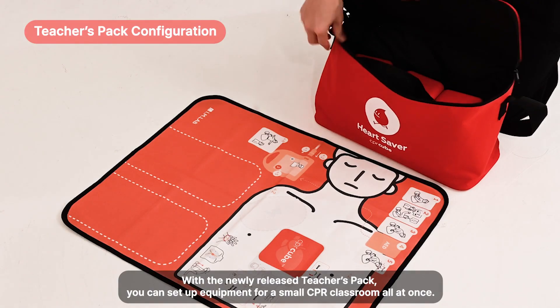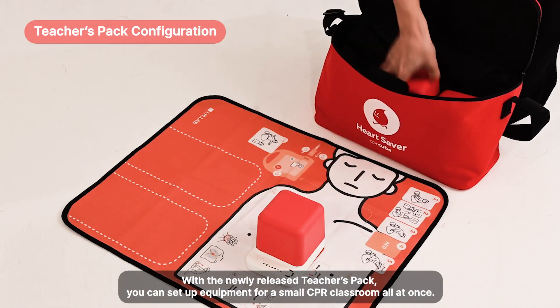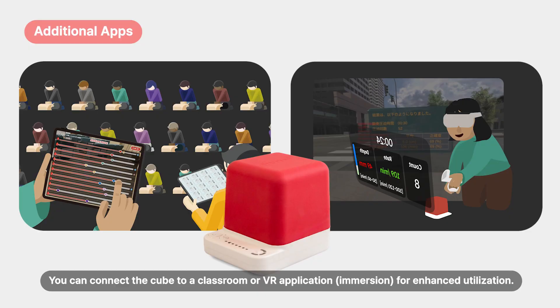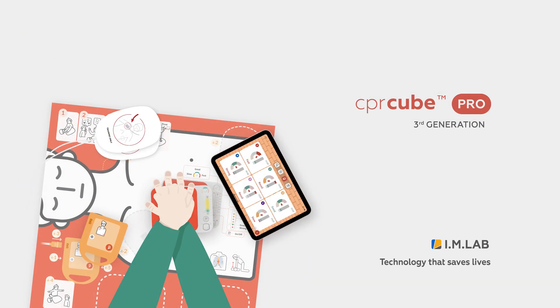With the newly released Teacher's Pack, you can set up equipment for a small CPR classroom all at once. You can connect the Cube to a classroom or VR application for better education. Complete Smart CPR Training with the CPR Cube.